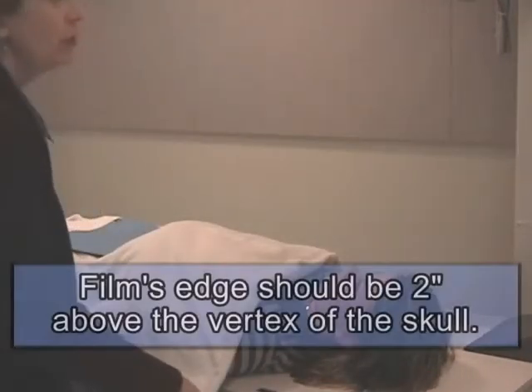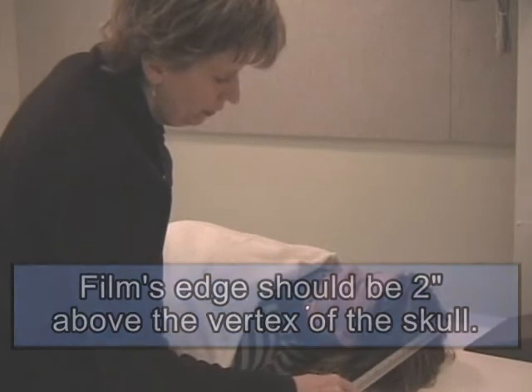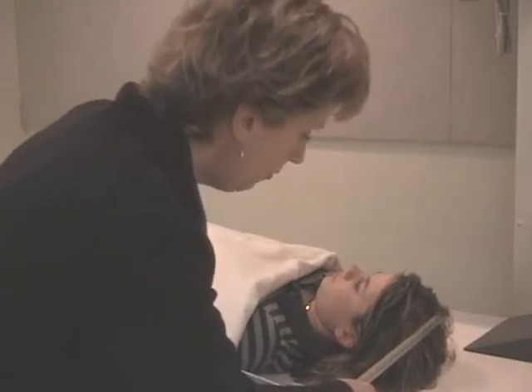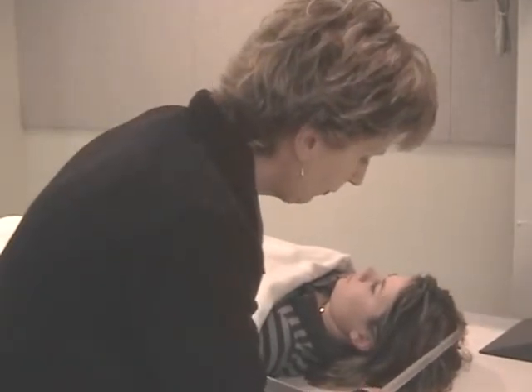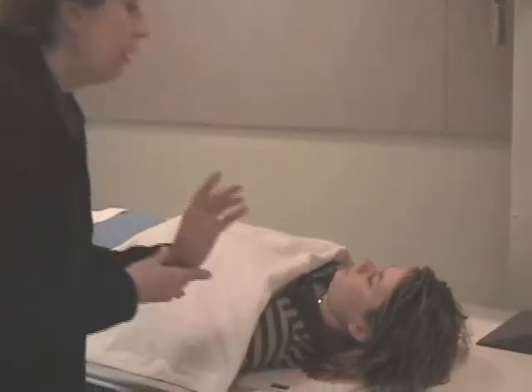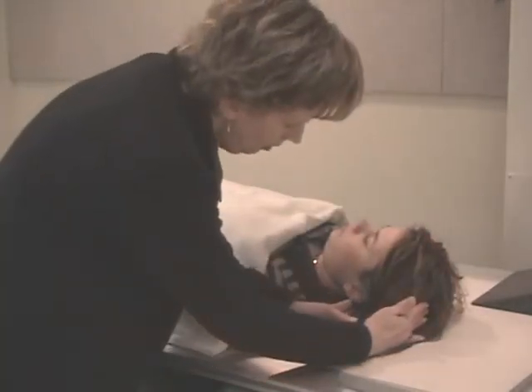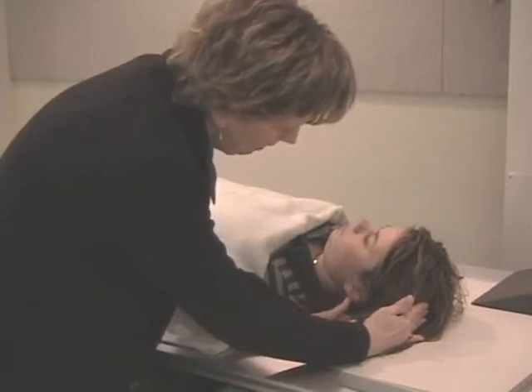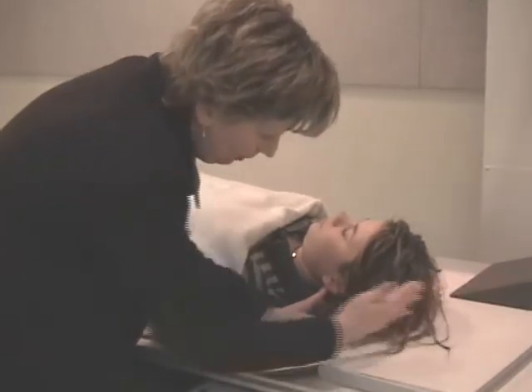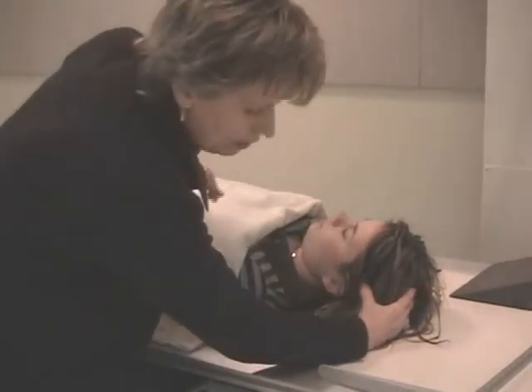The film's edge should be 2 inches above the vertex of the skull. You can put the calipers at the vertex of the skull and then center the film that way. So you've got the 2 inches clearance. Or another trick that I like to use, because the shapes of our skulls can be so different, is to find the vertex of the skull and the base of the skull. I can feel the mastoid tip there, and I divide the skull in half. Here's the top, there's the bottom, and halfway is where this crosshair should be. So I fixed my film.